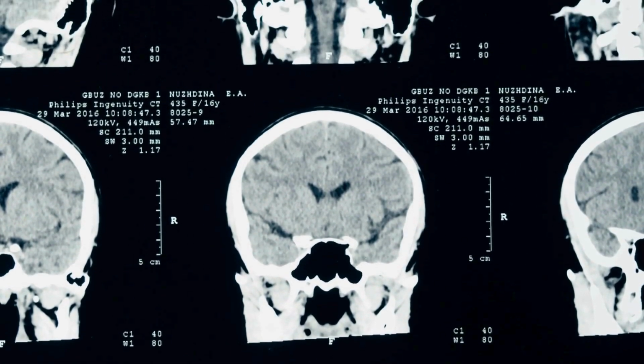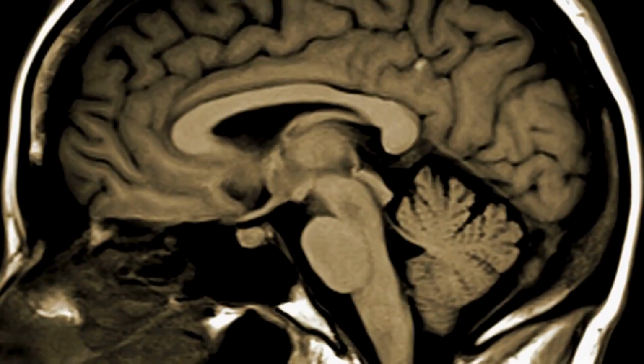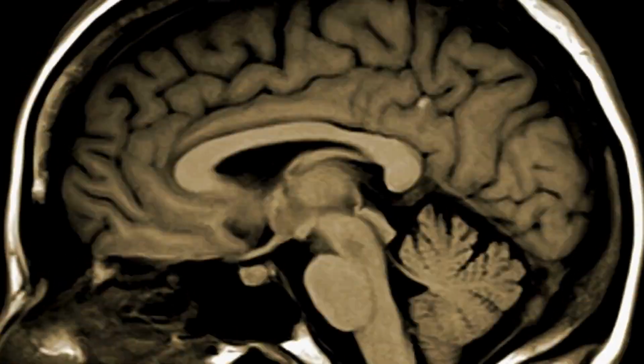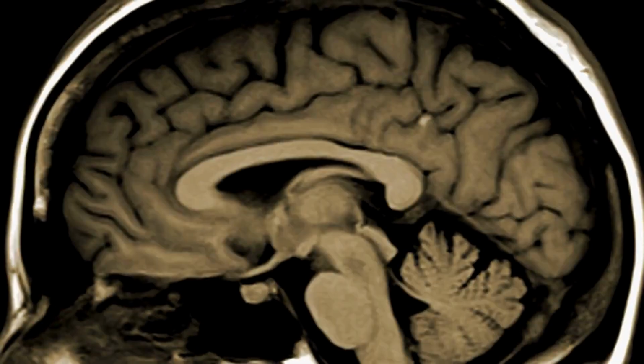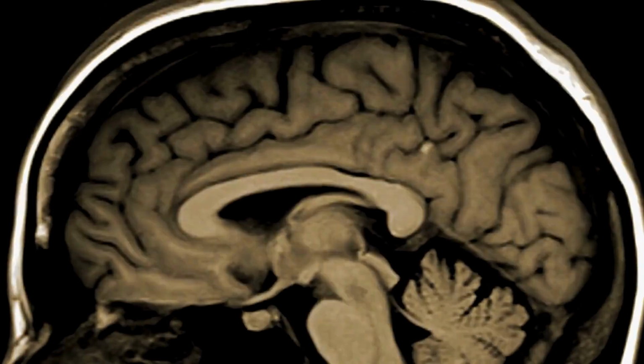It helps detect cancers at early stages, analyze brain damage after a stroke, monitor the progression of neurological diseases, or assess the condition of internal organs without surgery. It's like having super precise vision that can see through skin and bone.